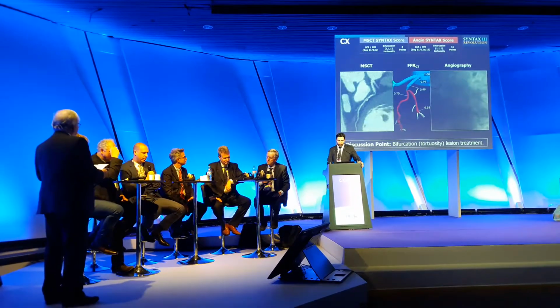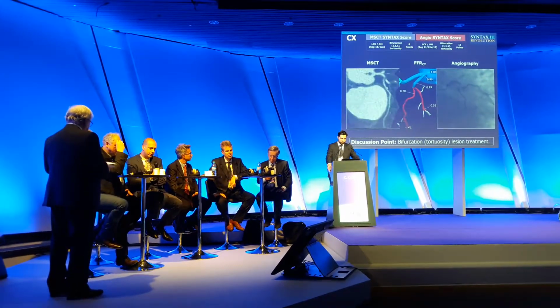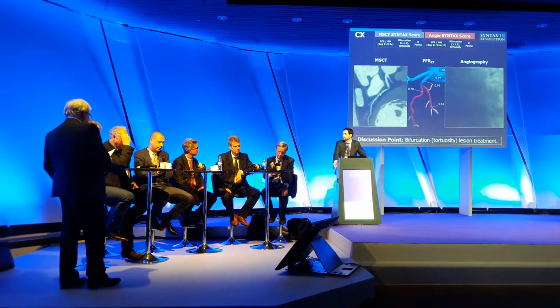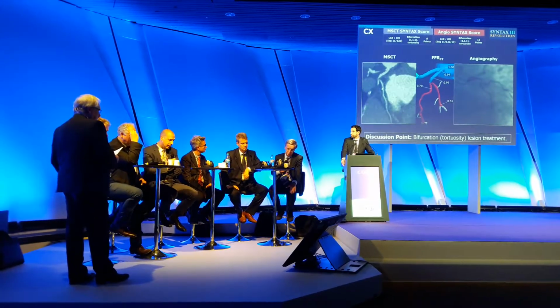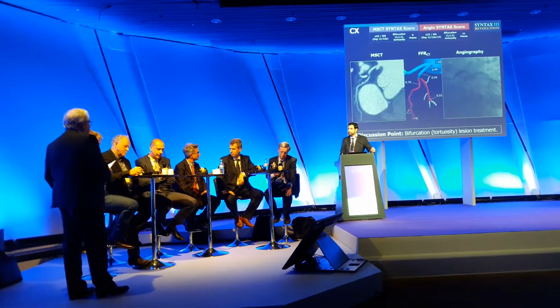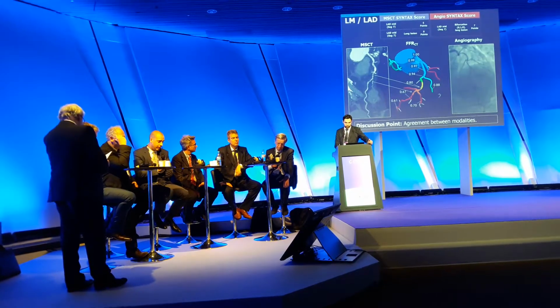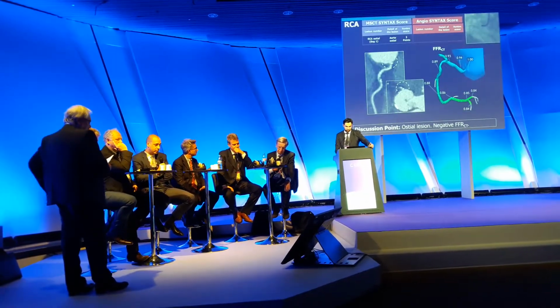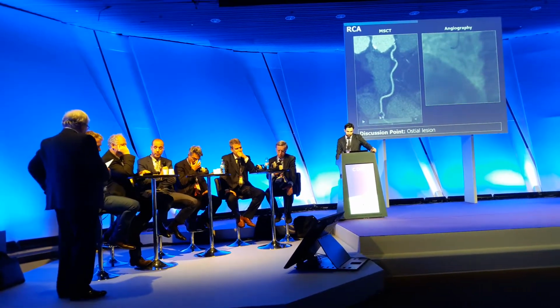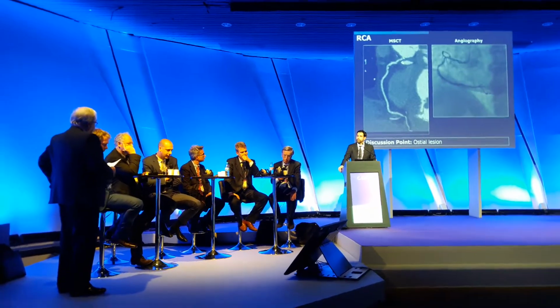Okay, thank you. Well, let's focus first on the clinical characteristics of the patient. 74 years old, diabetic, multi-vessel disease, slightly reduced renal function and left ventricular ejection fraction. Probably slightly more in favor of CABG for us. From an anatomical point of view, angiographically, we have our doubts on the proximal right. It's a moderate lesion on angio, and I would challenge this lesion by FFR if I wouldn't have my upfront FFR-CT as I'm used to nowadays.